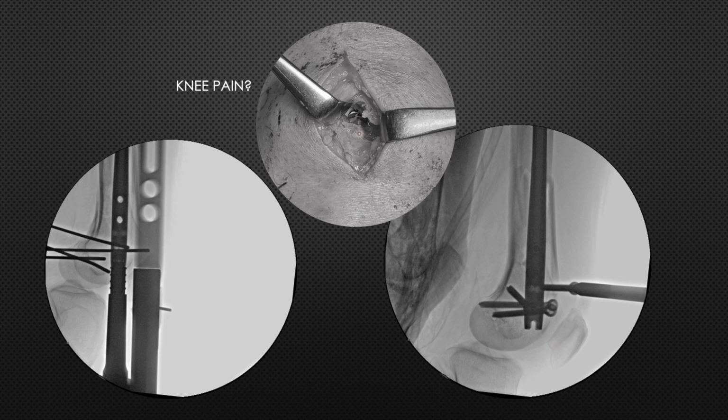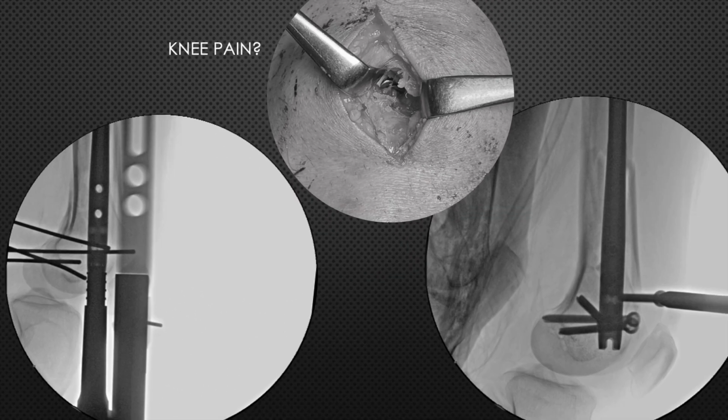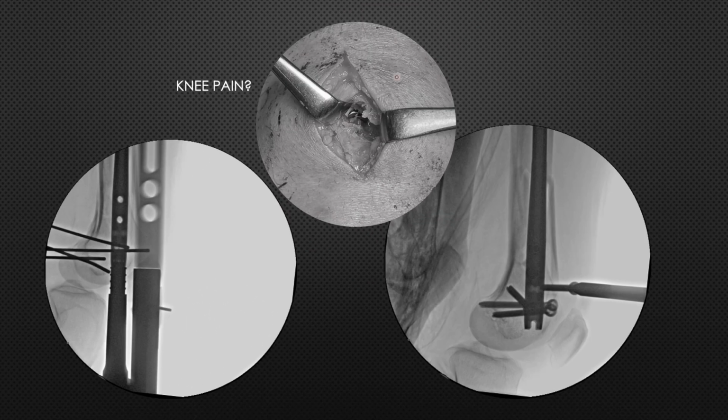Here you see the surgeon actually trusted the AP view. In AP view, he thought that the nail is inserted well, but when everything was done, he removed the jig. He saw that the nail was slightly proud. You see there is articular cartilage here, and the nail is slightly proud of it. So actually he has invited chronic knee pain for the patient. So that thing should be avoided. You should better insert the nail more, but making it proud is not a good thing.